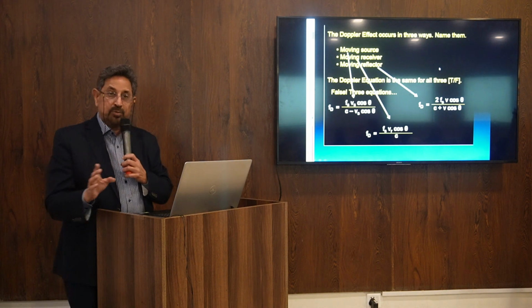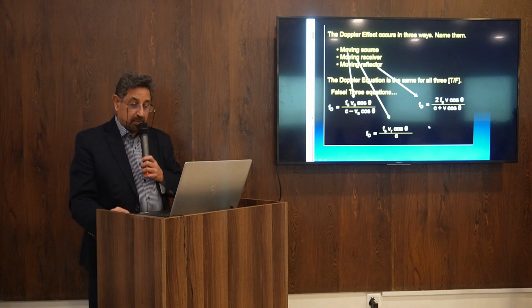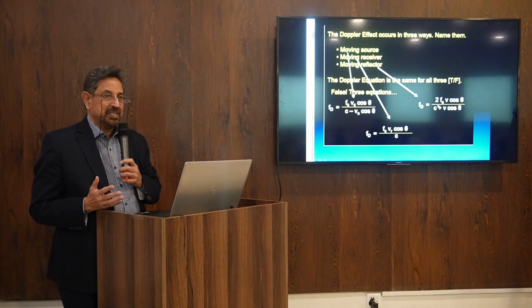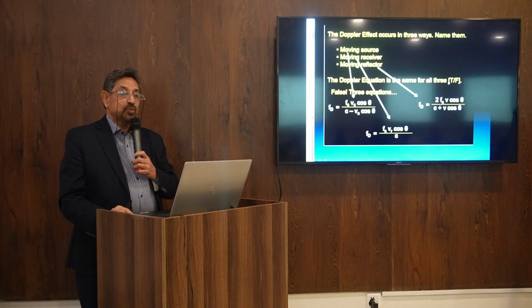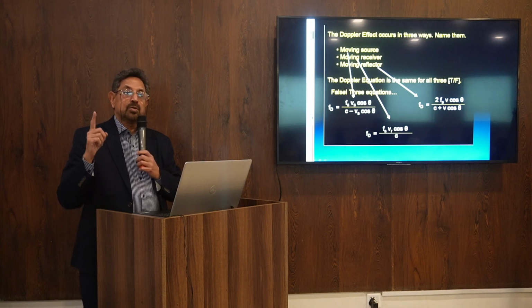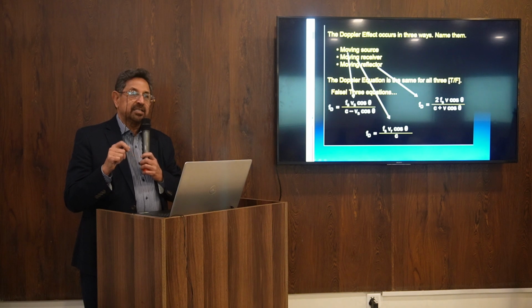You are not entitled to perform vascular Doppler unless you understand that cos theta 90 is 0. The mathematicians know that. We doctors are very bad in mathematics and physics. That's why we became doctors. But I tell you one thing, cos theta 90 means 0. So if you try to do Doppler at a 90-degree angle, you will get 0 information.